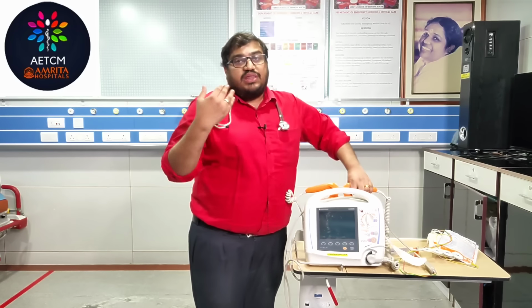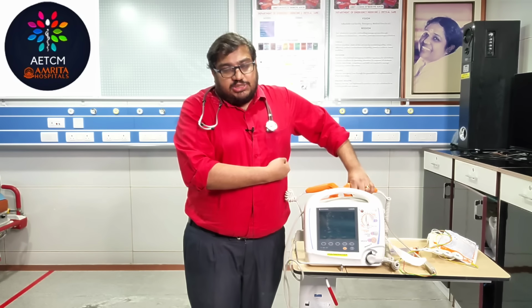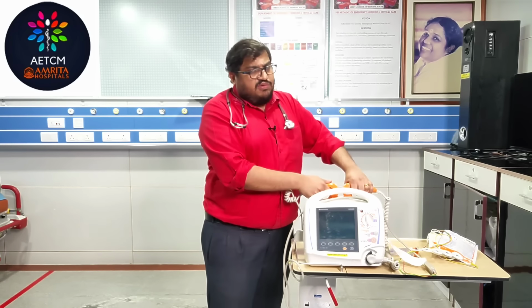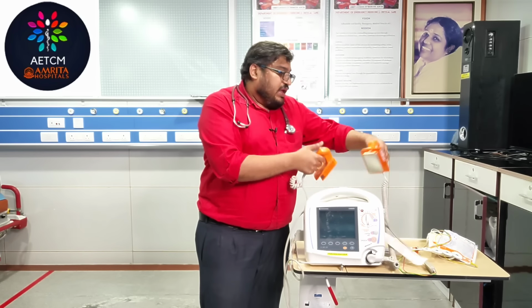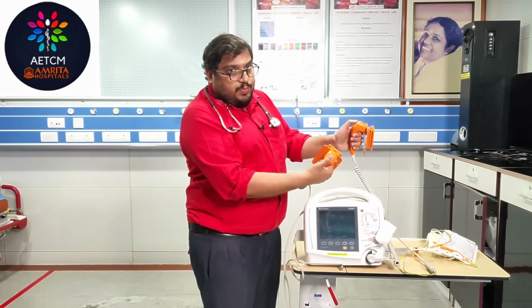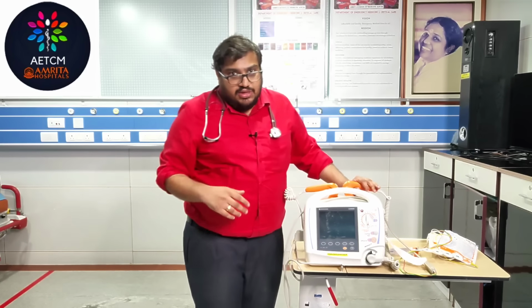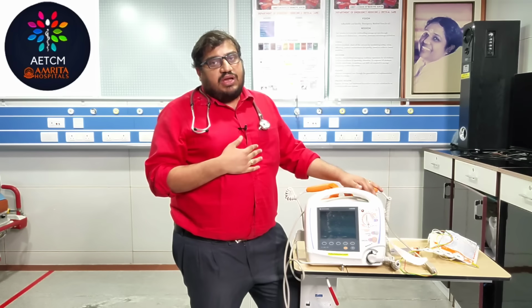As I told, one over the right side of your sternum and one over your apex, and make sure that no one else is touching. This is very important, because many of these things can go wrong. So make sure that no one else is touching. You shout, and you can see the shock delivery buttons here, two buttons, and you need to press these two shock delivery buttons, deliver the shock and resume the CPR. So that is the method that you have to adopt for defibrillation in case of a cardiac arrest.